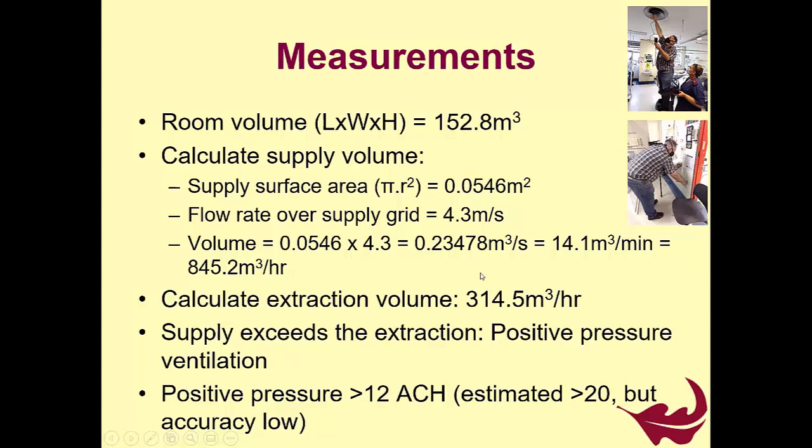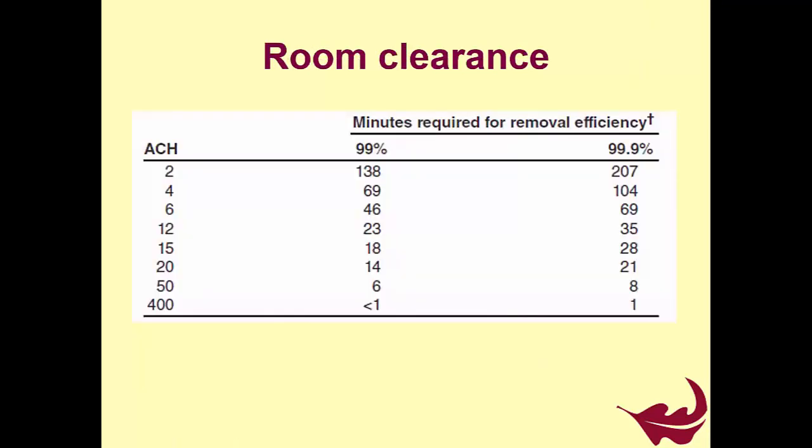And then the extraction volume I can get there. So this is the positive pressure, and you can also see with that incense stick that I showed you, this is how we do the calculation. So here I could estimate that we've got more than 20 air changes per hour in this hospital ward room, and you do exactly the same for the room where you will do this.